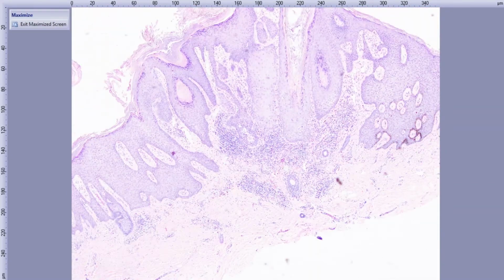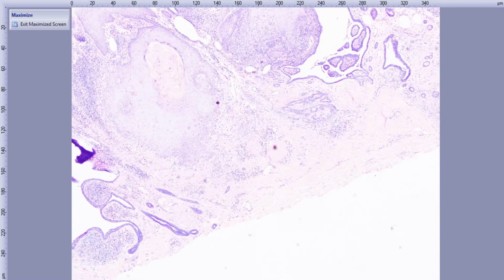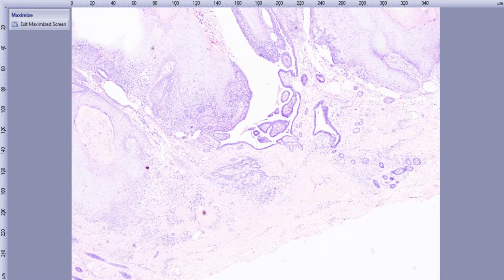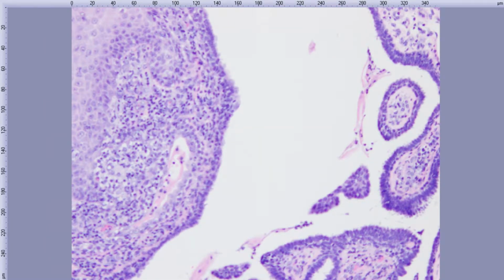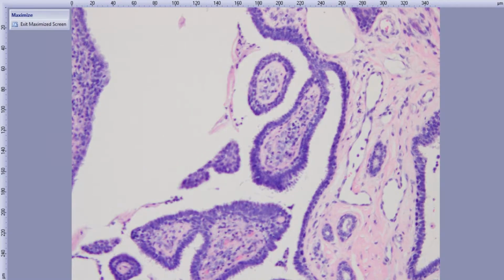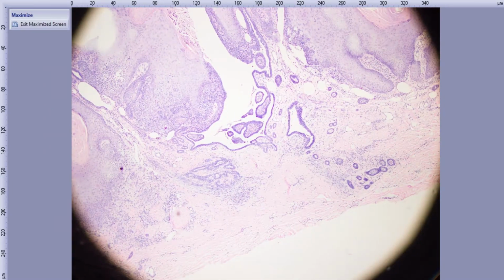That was on our in-service exam this year, and they gave us a really zoomed-up close-up picture like that where you didn't see the overall architecture. You just knew about the plasma cells, and they gave us HPAP and SPAP as choices. Oh, did they really? Okay. Yep. Good to go up close and actually home in on those. So that's what they gave us. They just want to mess with you, I guess. Was that the exam just at your institution, or the nationwide in-service? The nationwide. They had something similar to that.